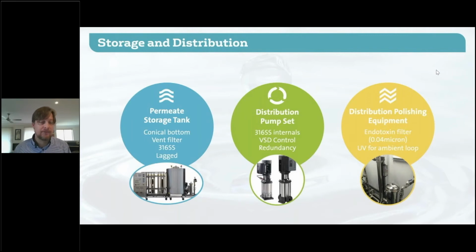at an appropriate velocity. And of course, you need to think about your redundancy here. This is a big risk point for the site. You've got your water in the tank, you've got to get it to the machines. If the pump goes, you can't do that. So having redundancy in the pumps, in those distribution pumps, is very important.